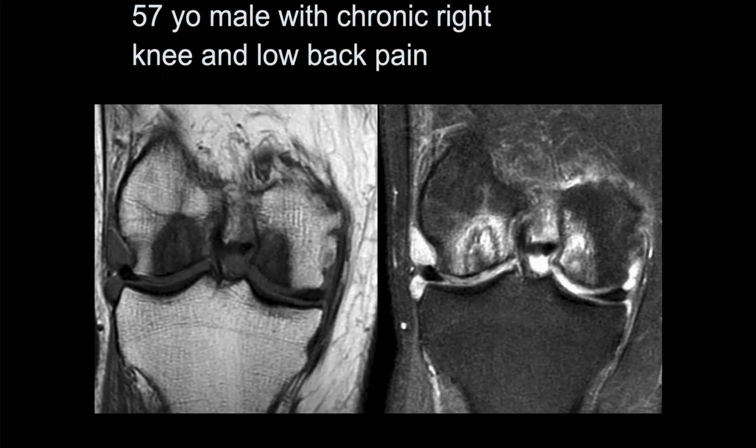And they grow with age, don't they, John? The nerve roots thicken with age. Is that what you're saying? Yeah. That I don't know, actually, John. Is that right? I think they do. You don't see that in children so much. I didn't know that. Thank you.